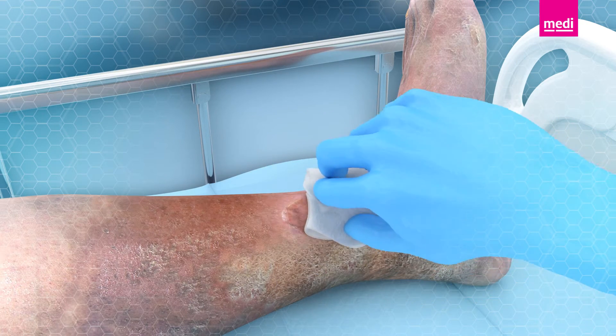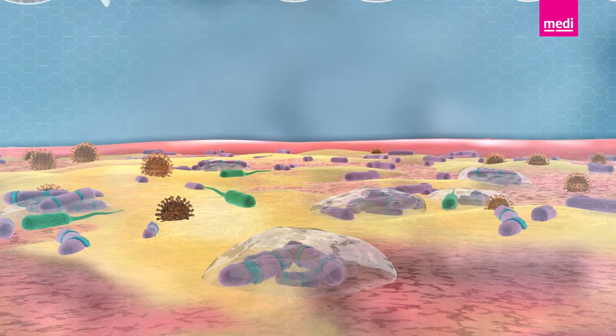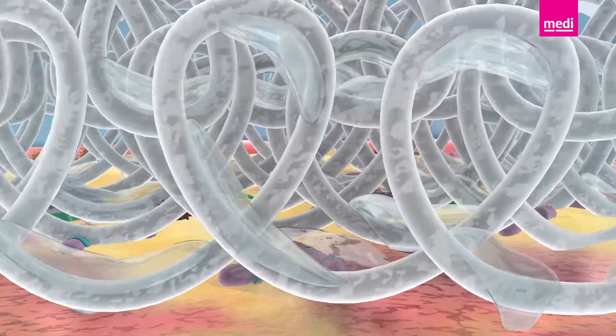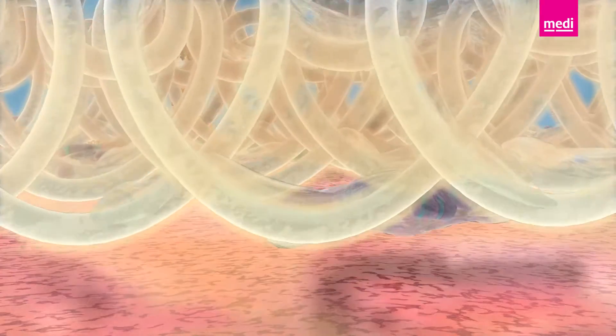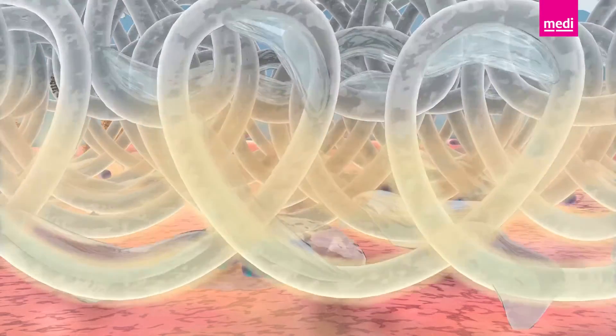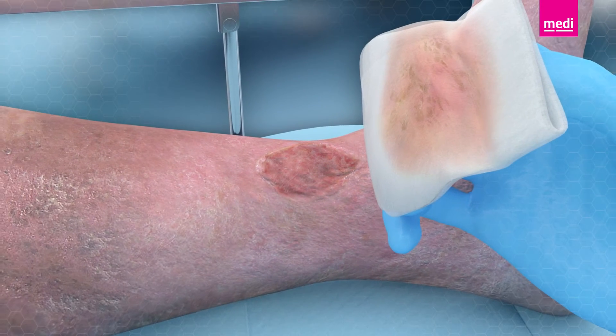Here's how it works. The UCS pre-moistened cloth softens necrotic tissue, plaque, fibrin and slough, trapping debris and biofilm in its fibres as it moves, effectively cleaning the wound bed and providing a healthy environment for the wound to heal.